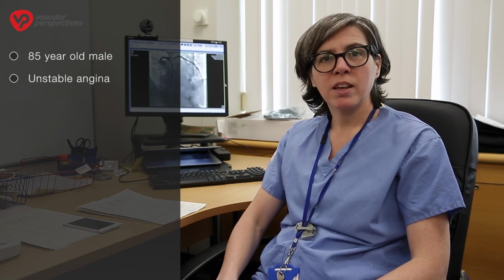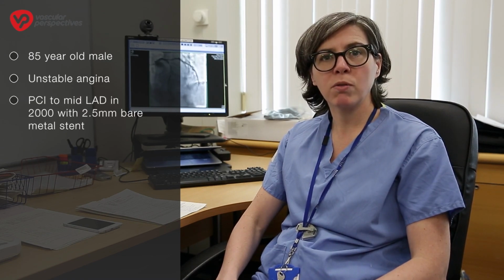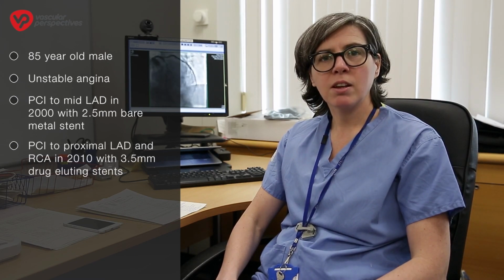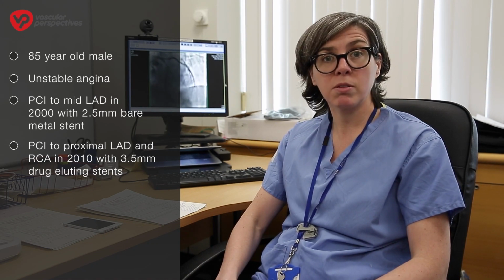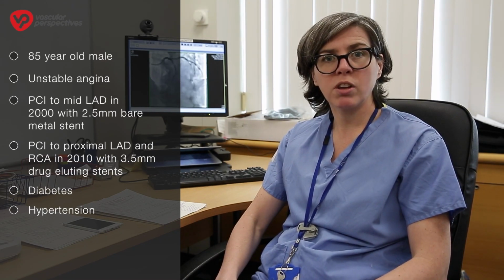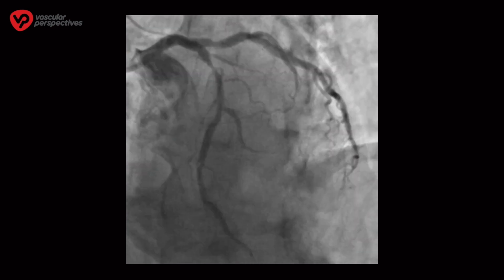I'm going to present for you today an 85-year-old man who came to me recently with unstable angina. He originally presented back in 2000 and had PCI to his mid-LAD with a 2.5mm bare metal stent. He then came back in 2010 and had PCI to his proximal LAD and his right coronary artery with 3.5mm drug-eluting stents. He's got diabetes, hypertension, and as I said, has now re-presented with refractory angina. So he attended for his angiogram.